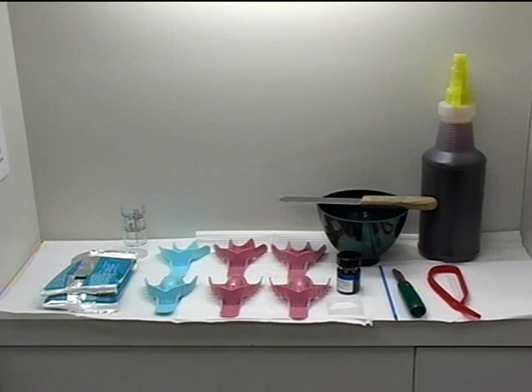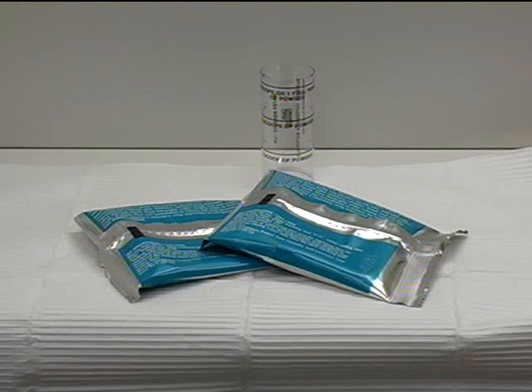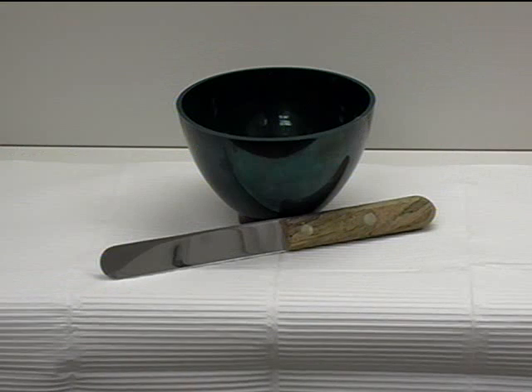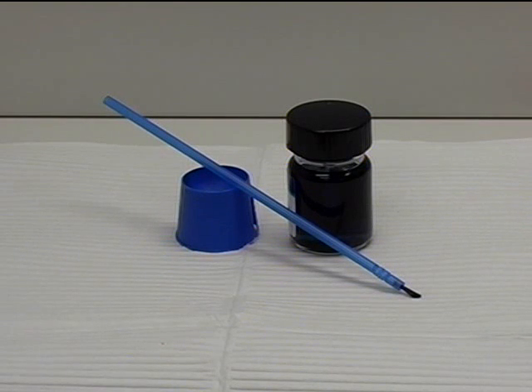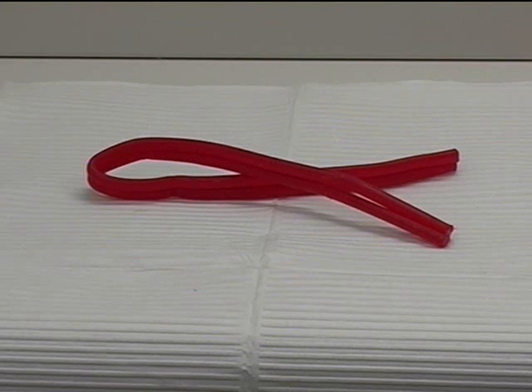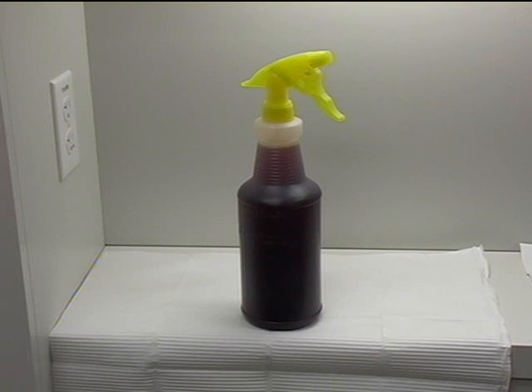Step 1. Materials needed. The required materials include alginate powder, either in bulk or in a pre-weighed sealed package, a water measure, maxillary and mandibular impression trays, a rubber bowl and spatula, tray adhesive, a small dish, a small brush, a lab knife, rope wax, and disinfectant spray. For this demonstration, we will use Vescadine disinfectant.